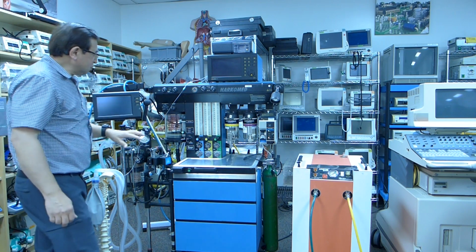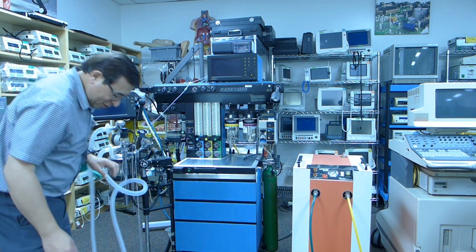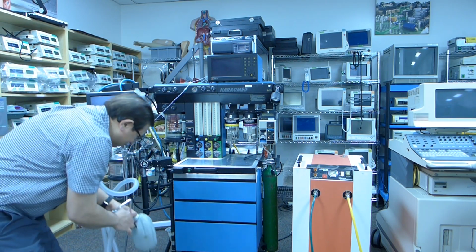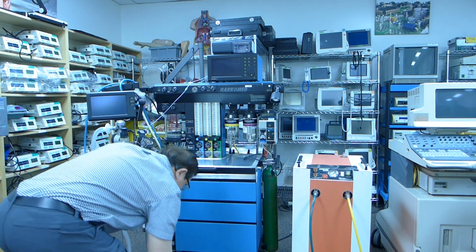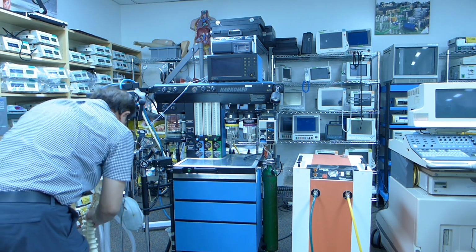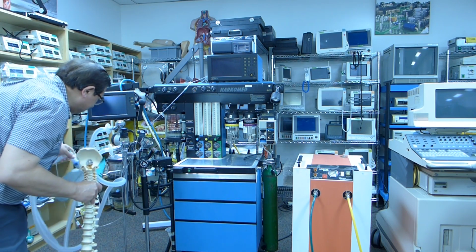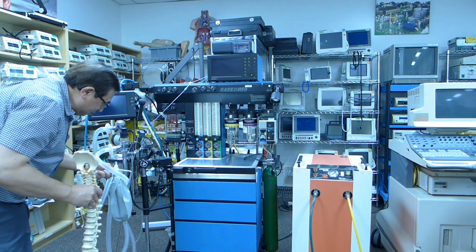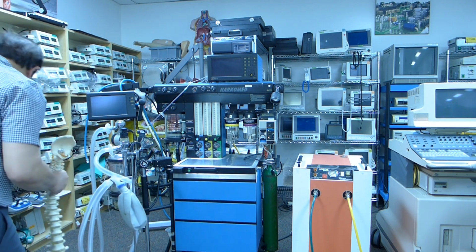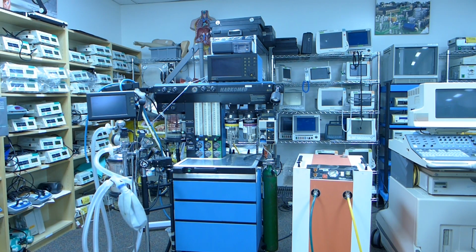So this machine here, we use this just to hang this test line. We're going to have to put this somewhere for now.